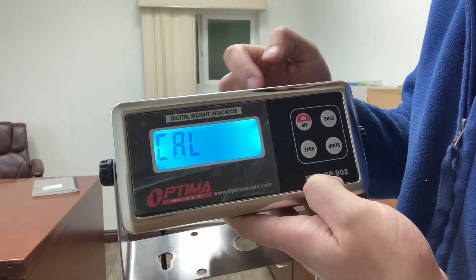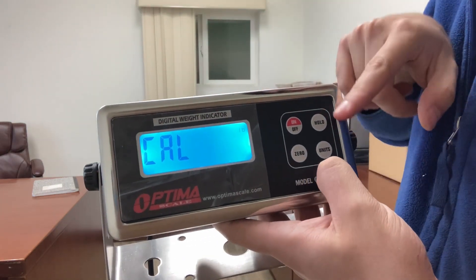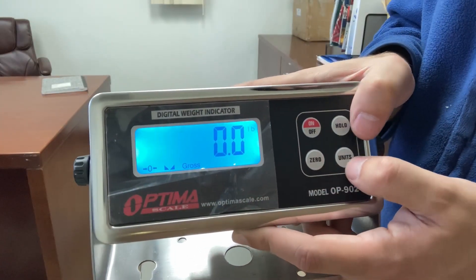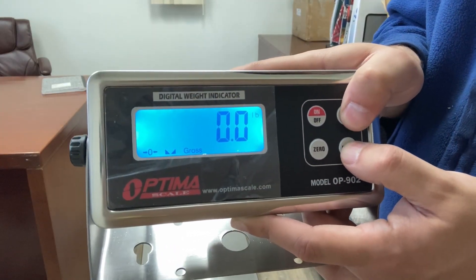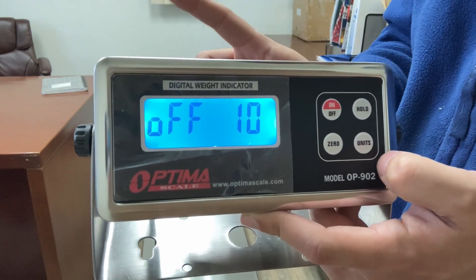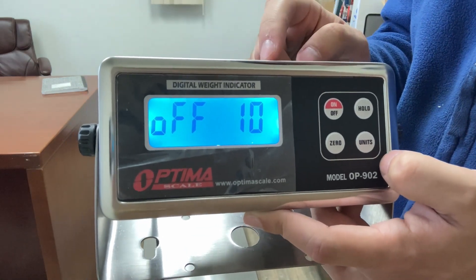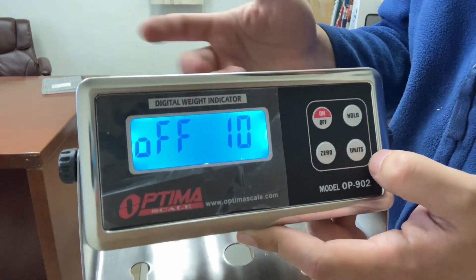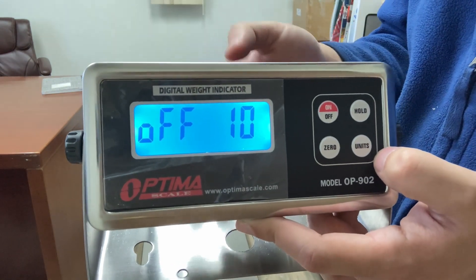If you don't see Cal, turn it off, turn it back on, and make sure you're holding the hold and units button for three seconds. If you press the hold and units button at the wrong time, you'll see off10 appear. That is not how to get into calibration settings — this is just for different settings like how long to turn off the backlight, settings that won't actually get into calibration.